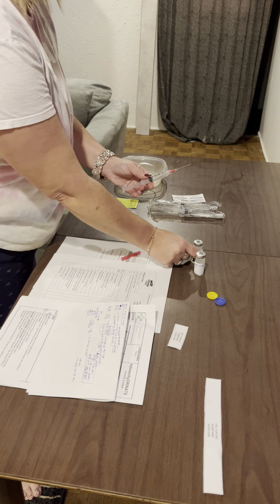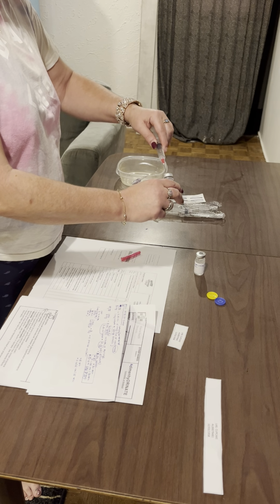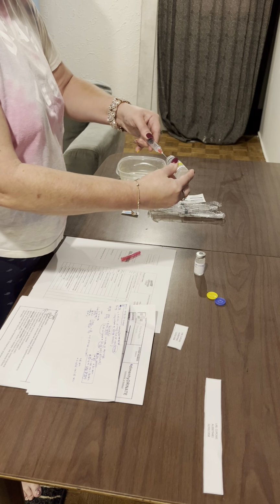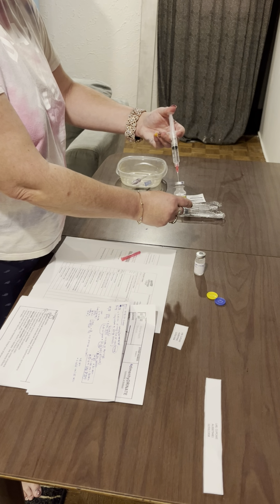And what we're going to do is take the cap off. We're going to pick up our normal saline. We are going to put it in against the wall. Just kind of put it in there against the wall. Great. And we are going to inject 4.5 mils of air in there.